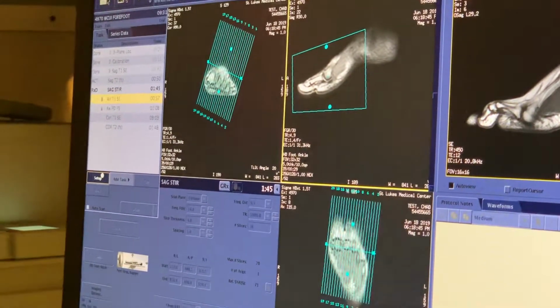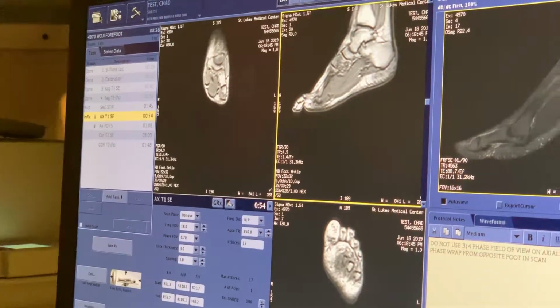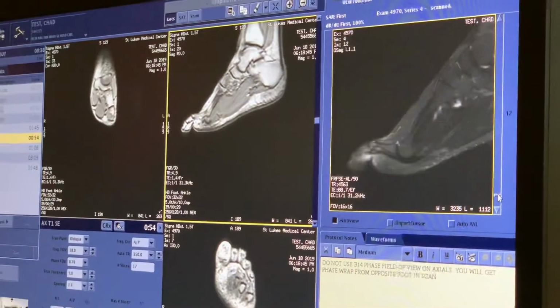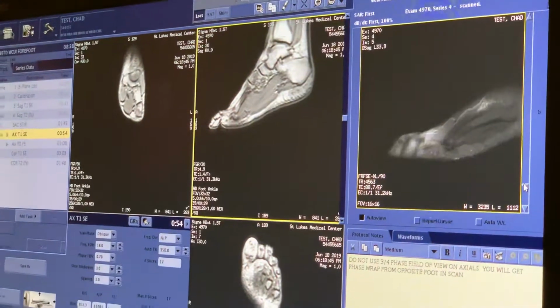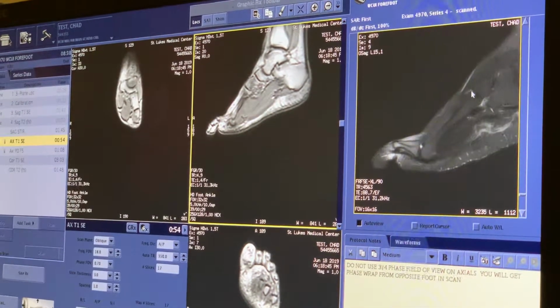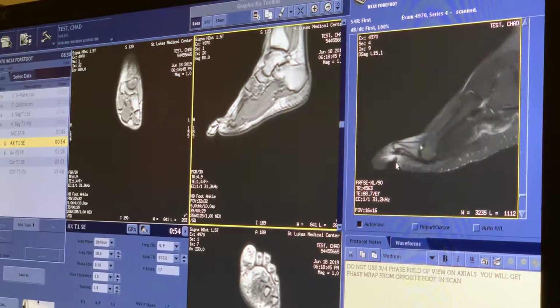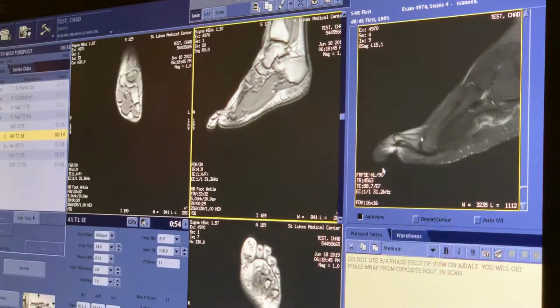Now axials and coronals. Here's another thing. All right, let's look at our fat sat. Not that great. So you can see here, this fat saturation looks really nice, but right here, do you see all this bright signal? That's where you have bad fat saturation.